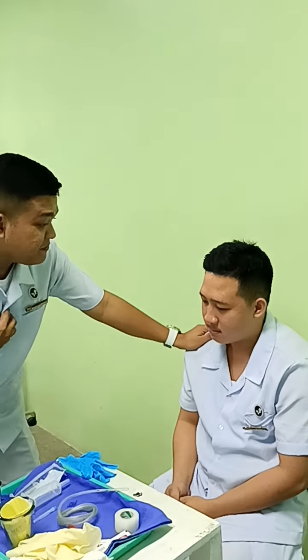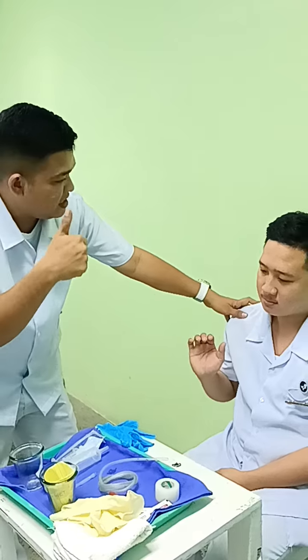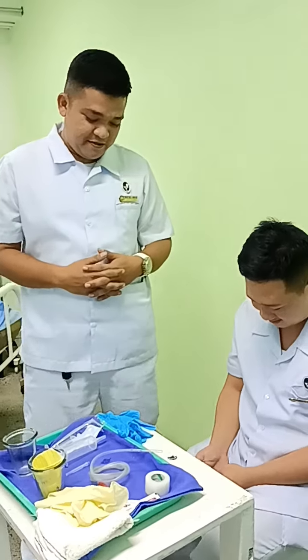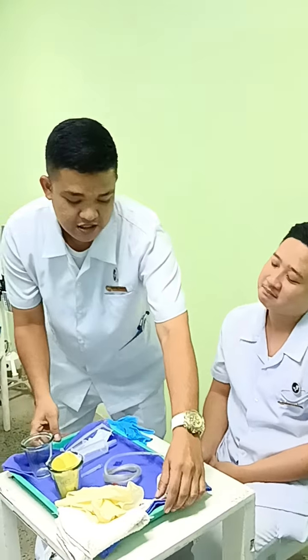Next is to explain to the patient the hand signals. We wash our hands and wear gloves. Sir, if you feel any discomfort, you can just sign like this and like this. Okay? Okay, sir? So for the next procedure, you have to prepare the equipment needed. It is very important to place the equipment near you so that you will not have a hard time reaching it.